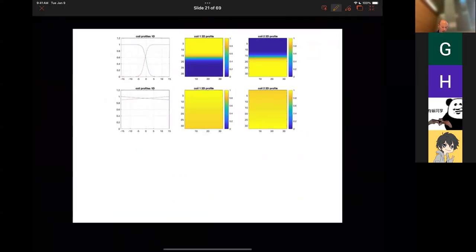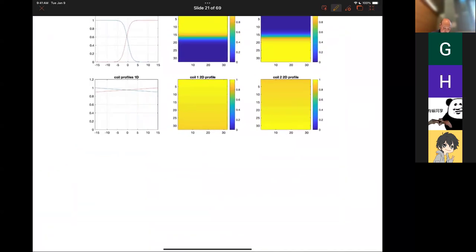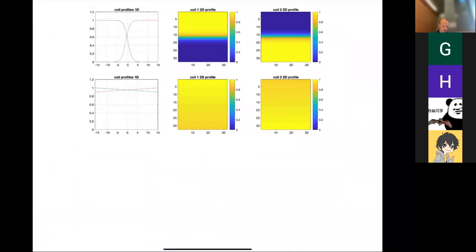So let's look at this example here, right? Let's go back to thinking about the vectors that would correspond to this. Remember, we want to look at the coil sensitivity patterns. For example, for coil 1, let's say we pick a point here, -10, and then we go FOV/2 over, half an FOV is there. The two values in the coil sensitivity pattern we would enter would be 1 and maybe close to 0, for coil 1.